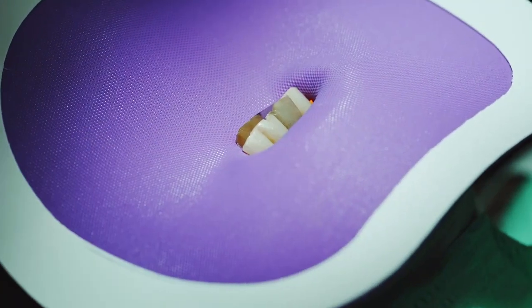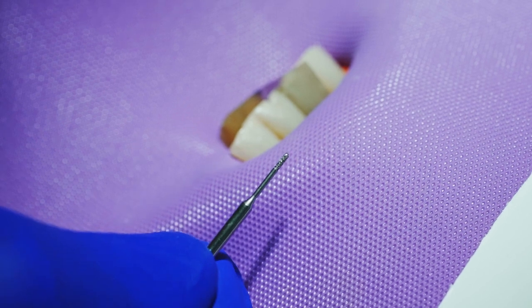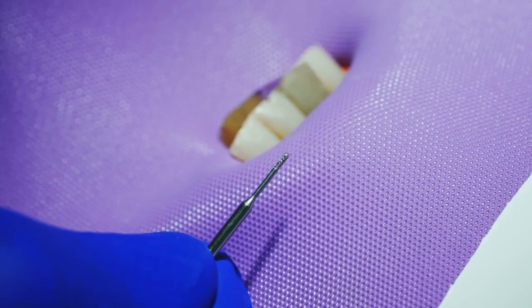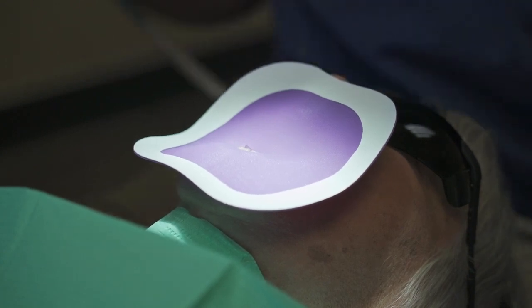We will now take the burr that comes with the kit. It's a micro pear-shaped burr, about two millimeters long, and slightly larger in diameter than the device that we'll be inserting. It is a diamond burr, so you'll have multiple uses with it. Put this in the handpiece — the reason we use a burr is it's easier to cut through dentin and enamel.